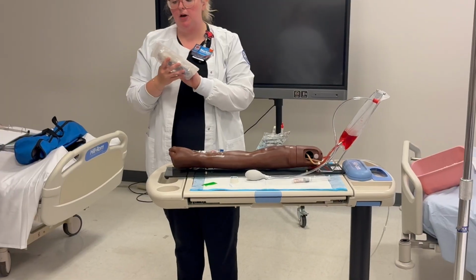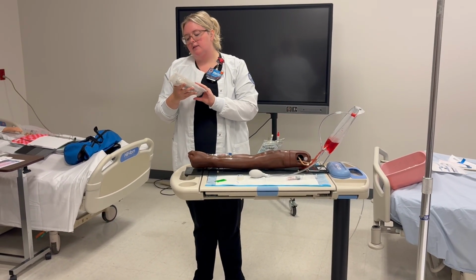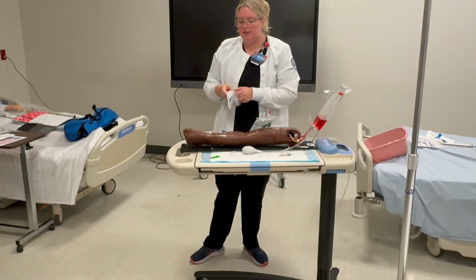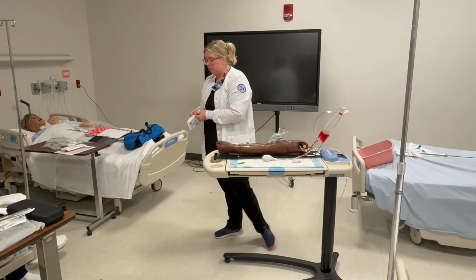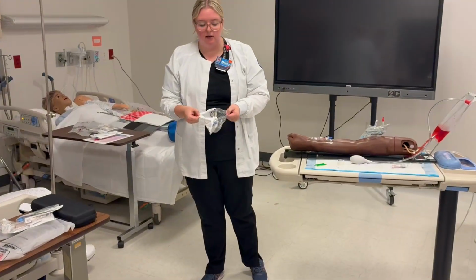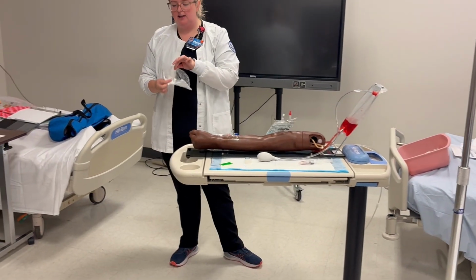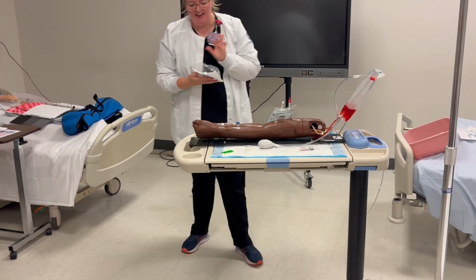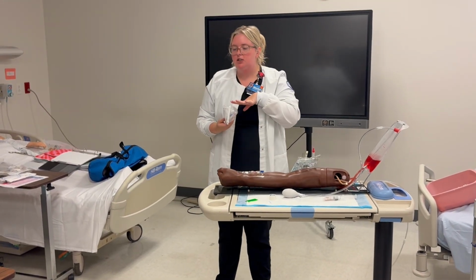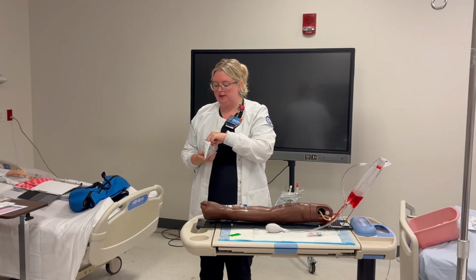So this is the primary tubing. It's labeled on here as solution set. It's just a lot longer than the other one. So this Baxter tubing, I just know this from using it. It has a little perforation here. Some of you guys rip into it like a rabid raccoon trying to get chips, okay? So it's made to be opened easily, okay? And this also creates your little bowl in real life. Like this is where I would prime into. That's just a real life versus in here, but we can use trash cans in here.